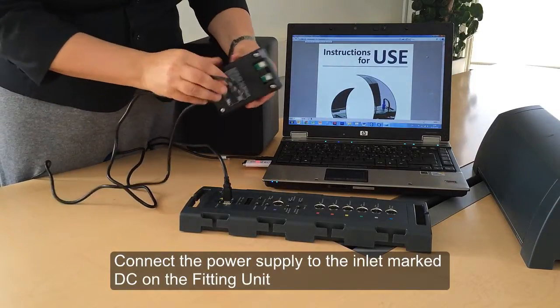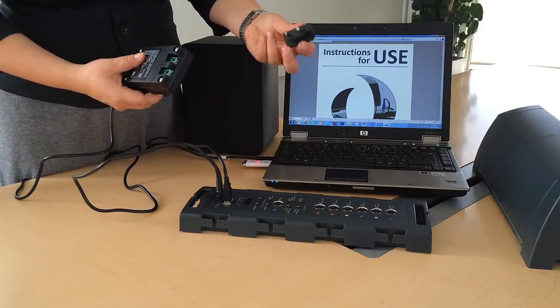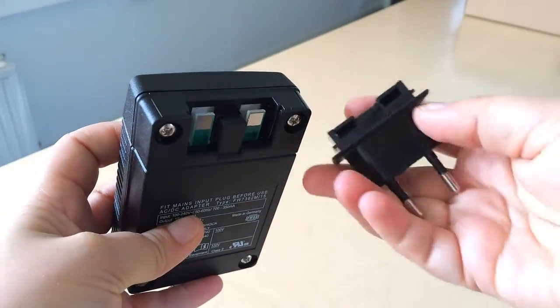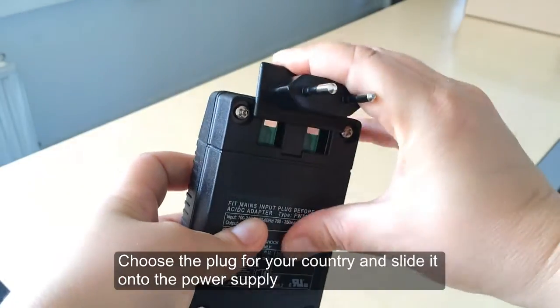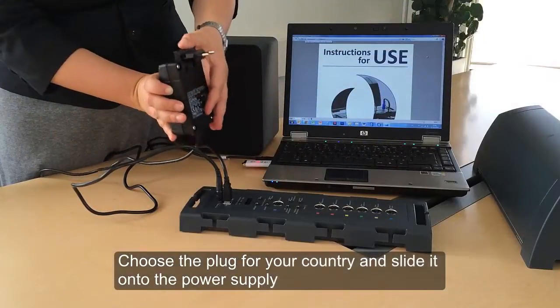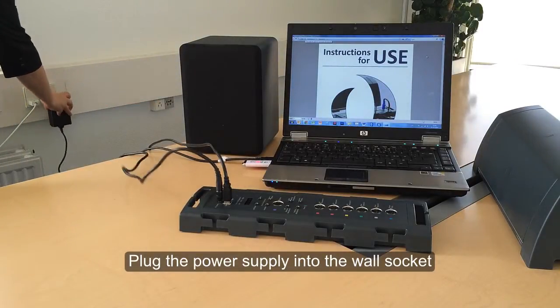Connect the power supply to your fitting unit. Make sure you've selected the correct plug for your country and slot it into your power supply as shown. Now connect to a power supply.